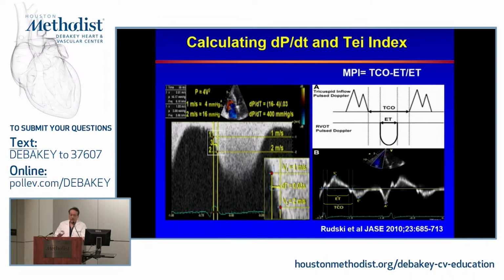Another thing that can spare you the multiple cycles that you have to deal with is to look at the tricuspid tissue Doppler signal. And here we have the systolic ejection signal. We have an isovolumic relaxation velocity, early diastolic and late diastolic velocity. And so now it's easy. I can get all my time intervals from here. Having said that, the challenge with that is it's 1 point, meaning just that lateral side of the tricuspid valve.